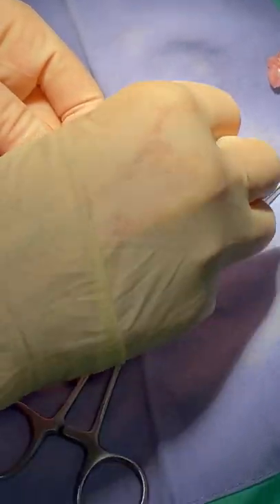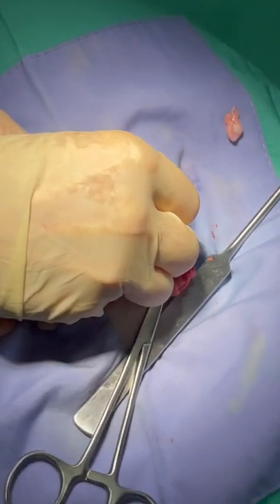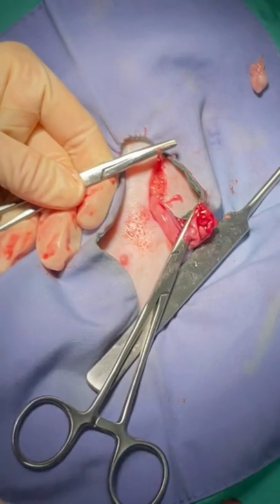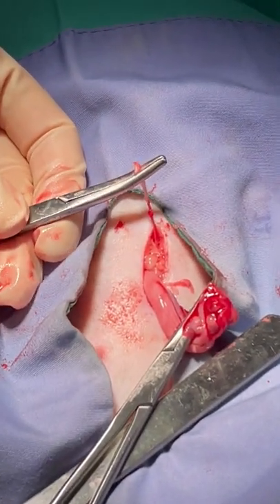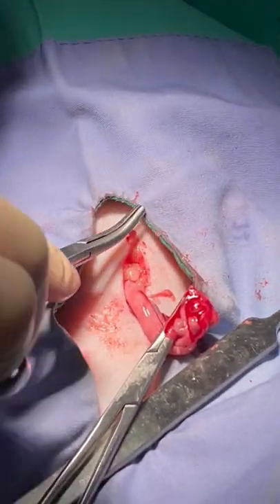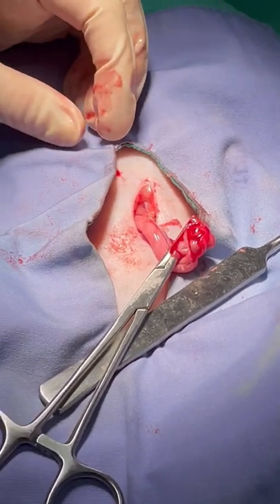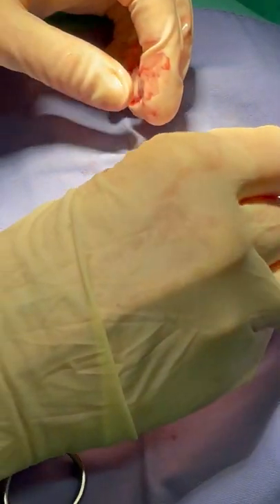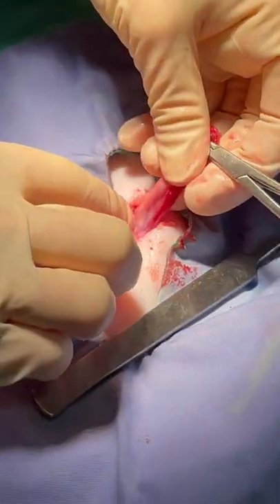I'm going to move the fat out of the way and make a knot. The only thing that can happen if I tie this properly when I push this over is a knot — that's called a pedicle tie. We tie it on itself rather than using suture. Suture can slip; pedicle ties don't slip. They also don't require suture, and they're much faster when we do high-volume spay-neuter.